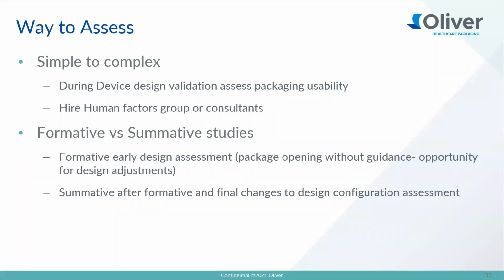And then the opposite, the summative, is where you will actually guide the end user on the correct way to either open or use, and then you will observe to ensure that what's being guided has actually occurred.